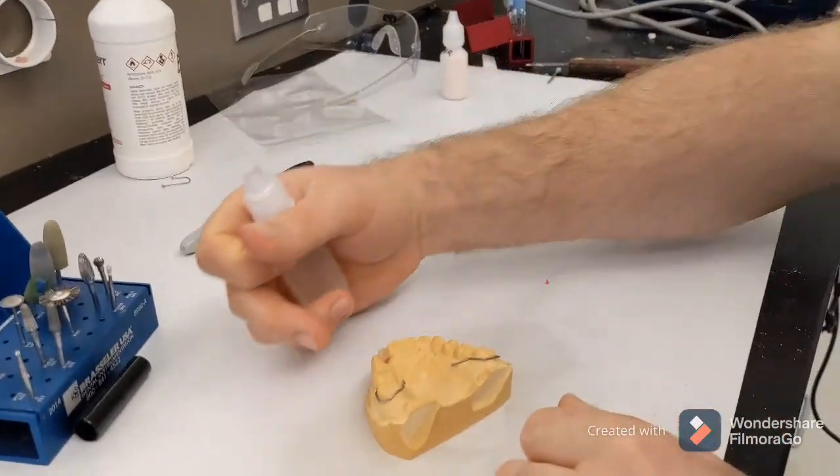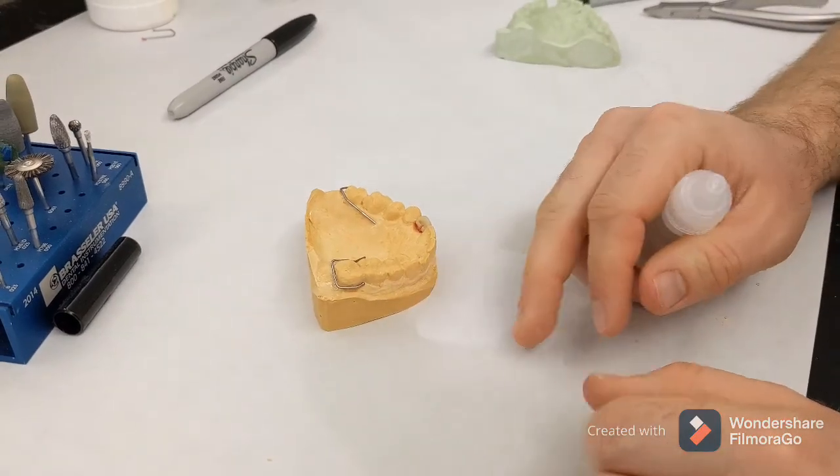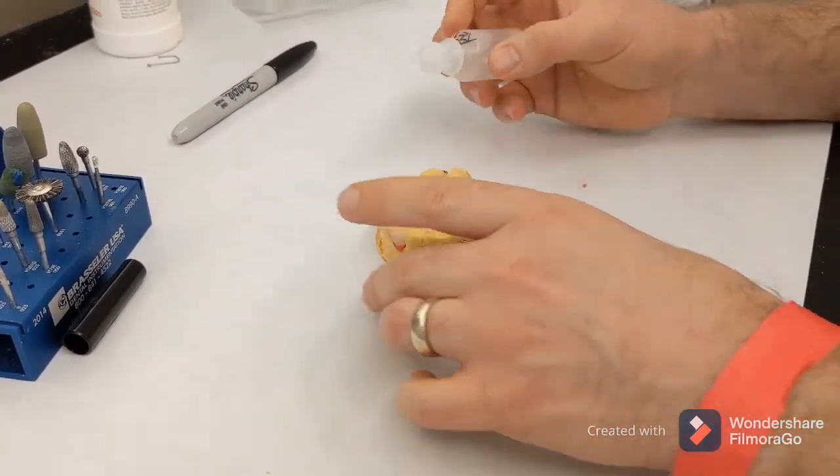We've bent our wires so they engage in the interproximals of the teeth. You can see there. And then we're going to use the sprinkle technique for this part.